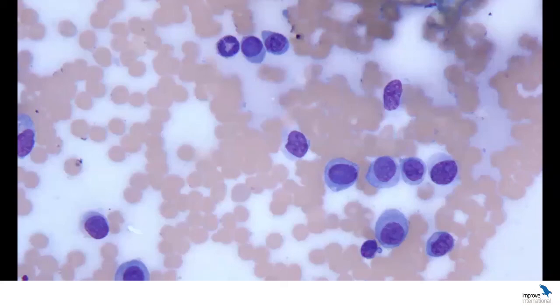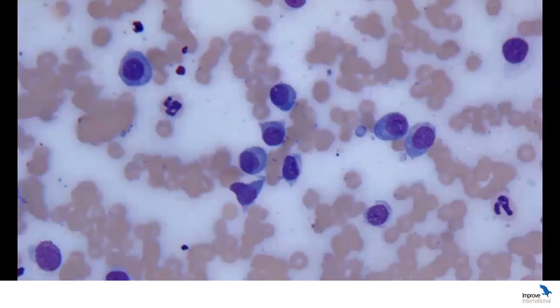Do we have a basophilic cytoplasm, really dark, with that zone of paler central area? And it doesn't seem the case here. So when I see discrete round cells that look like fried eggs, then I think of histiocytomas.